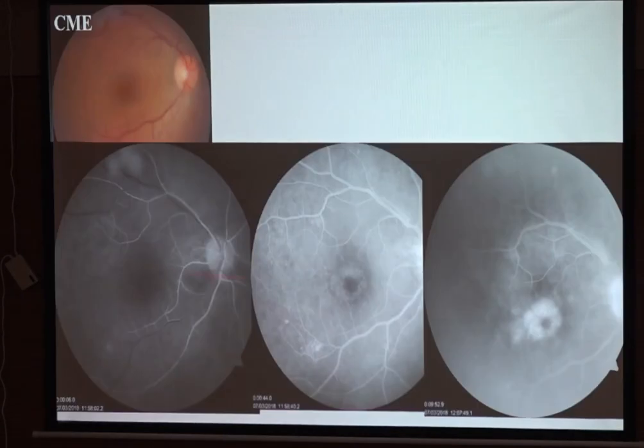This is again a very classic example, and come out with a diagnosis. What is this? This is the early frame. It goes on increasing the hyperfluorescence in the late phase. So this is leakage. She's written the diagnosis. At least read out and see.